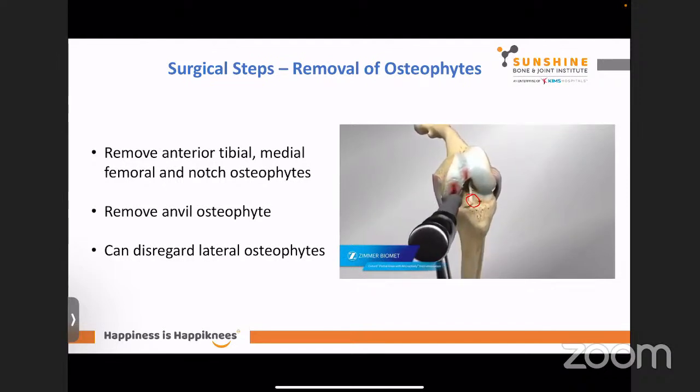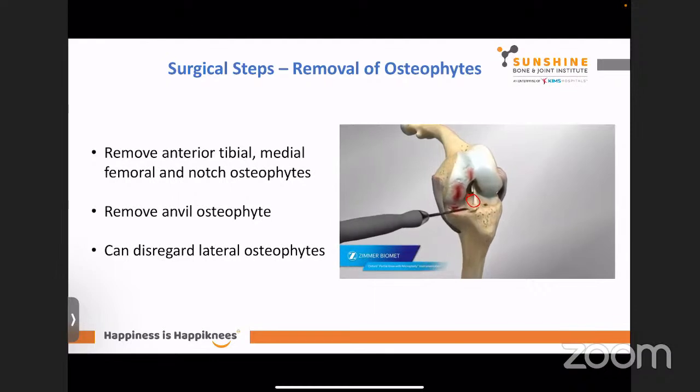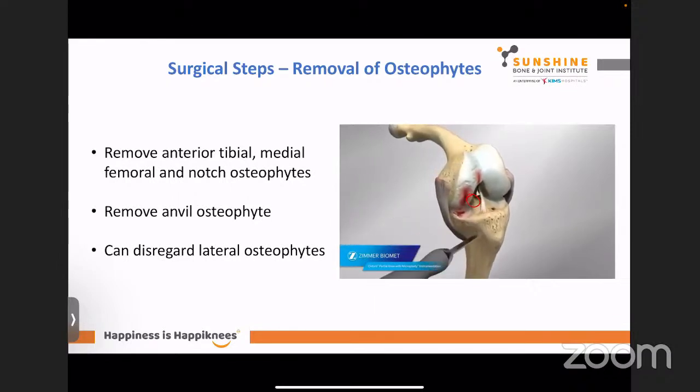Take out this notch osteophyte. It's very important because this notch osteophyte will in due course of time remove the ACL. And then this anvil osteophyte, which will prevent full extension. So you take that off.